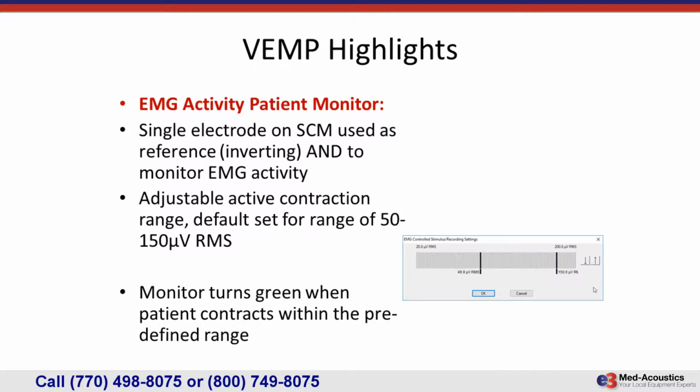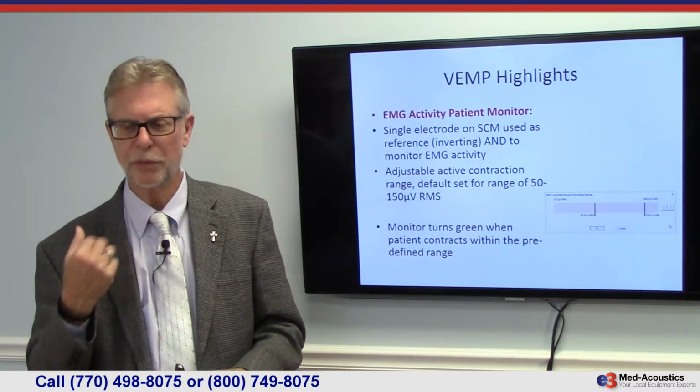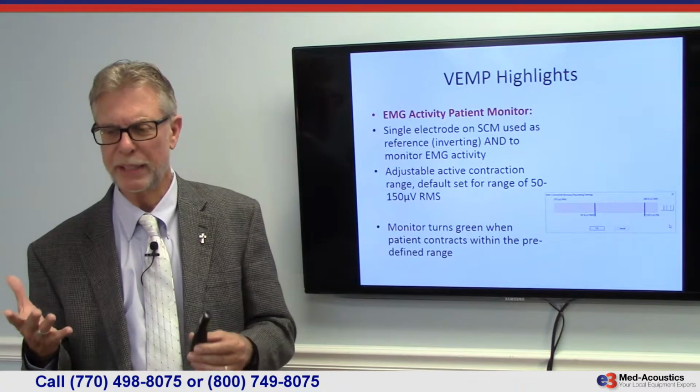So, remember I told you that an option on the Interacoustics Eclipse system is an EMG monitor. That's something that we always wanted, because something that could cause us a false positive in a cervical VEMP is that the patient uses more effort or less effort as they're contracting the sternocleidomastoid on the right versus the left. But if we had a way of monitoring that, it would make it easier.